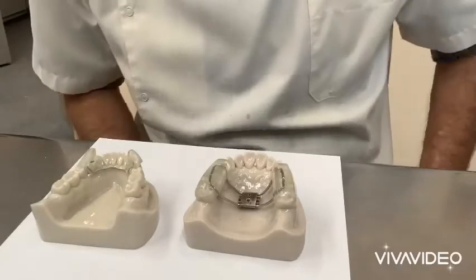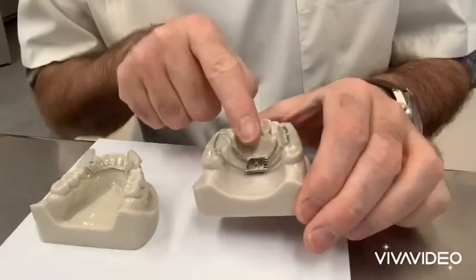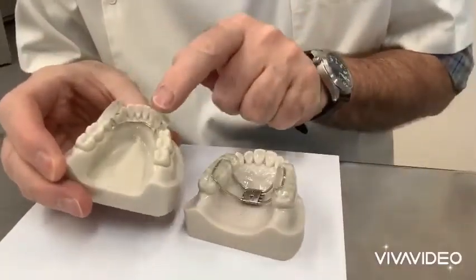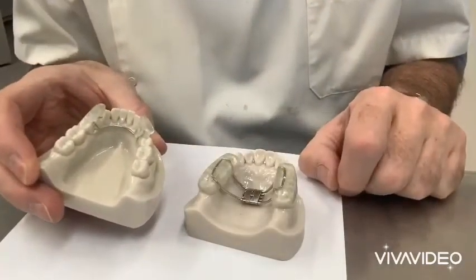Hi, I'm Graham Manley from OrthoLab and I'd like to show you the fixed twin block. So this is the appliance. It's a two-piece appliance. The upper has a screw in the middle, the lower has a lingual arch and two blocks, and this is bonded in, very similar to a bonded hyrax.